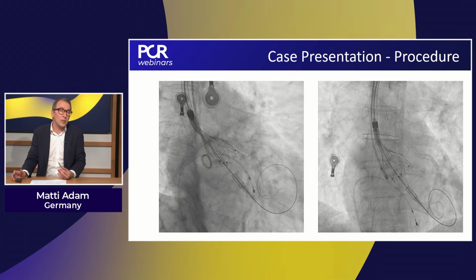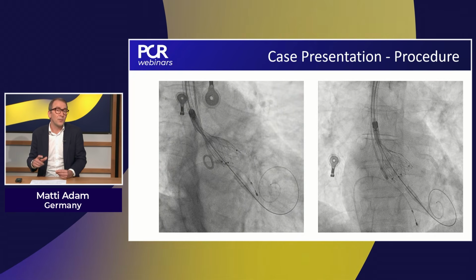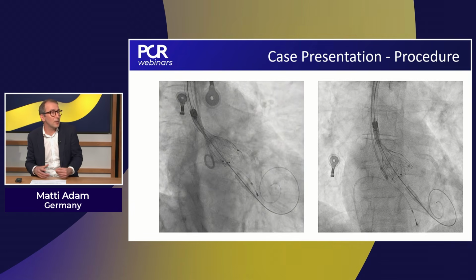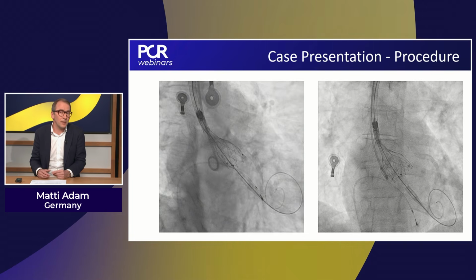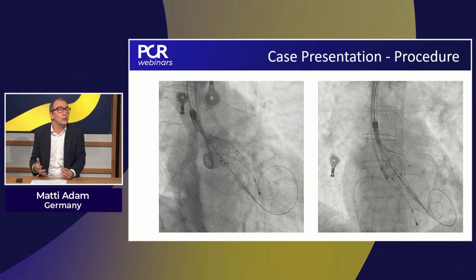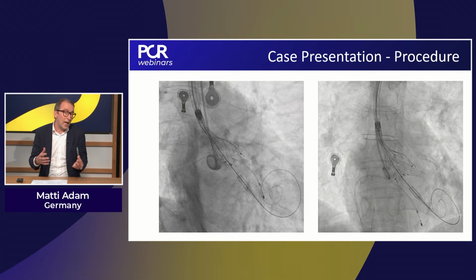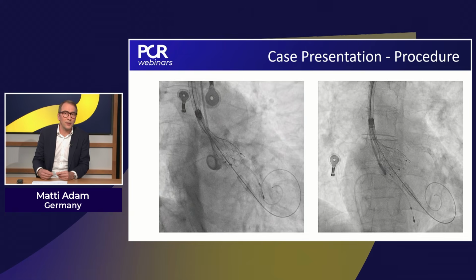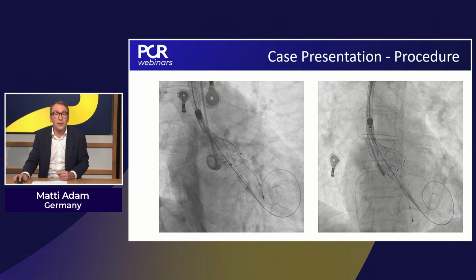We brought in the system, and then, when we talk about patients with coronary artery disease, especially if we're saying there will be some stenosis that might come up in younger patients, maybe later for treatment, I think commissural and thereby coronary alignment are important. So we're looking in cusp overlap on the left-hand side for a 2-1 configuration of the vision markers, which we have. We confirm height. Also, I think height-wise we were good on the non-coronary side. We confirm height on the left. You see a 1-1-1 configuration. Again, we're happy with commissural alignment and height on the left.